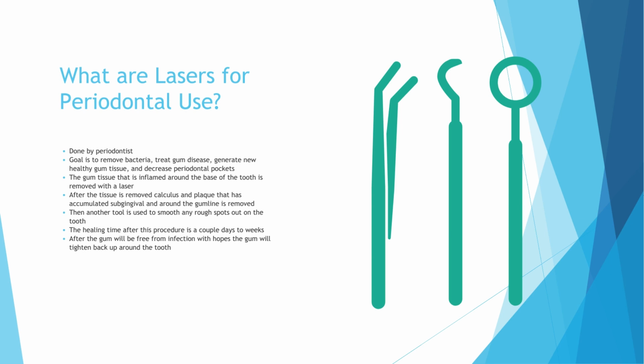The healing time after this procedure is a couple days to weeks. Normally, it's 7 to 10 days to be precise. After, the gum will be free from infection with hopes that the gum will tighten back up around the tooth.